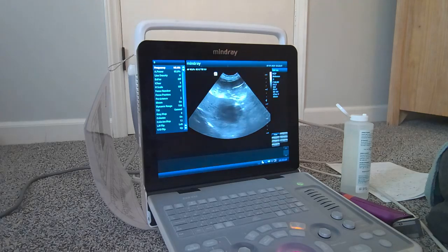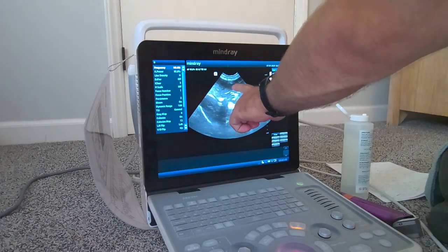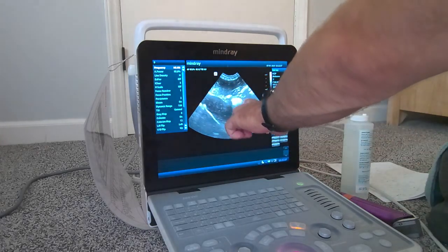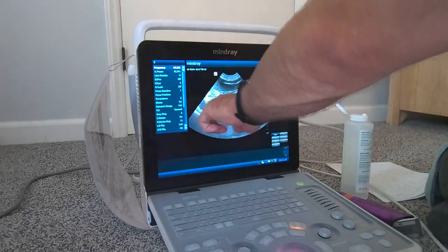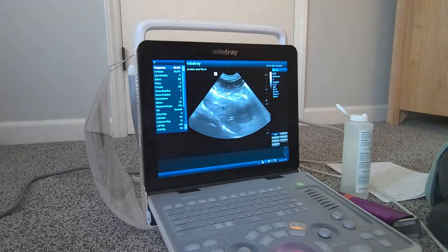So we have the gallbladder just right of midline when I'm doing that subxiphoid approach. Coming back up towards the left side to get the left side of the liver, we actually start getting spleen into the image, and you can see all the gas within the lumen of the stomach sitting along here as well. So you're already seeing the wall thickness and so on within the stomach. It's all gas in there. He's pretty empty. He hasn't eaten today; I tried to keep him fasted this morning.